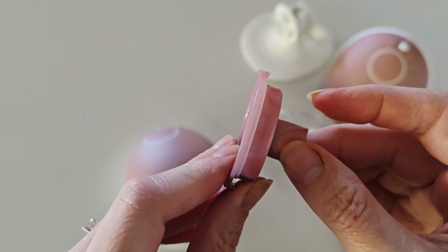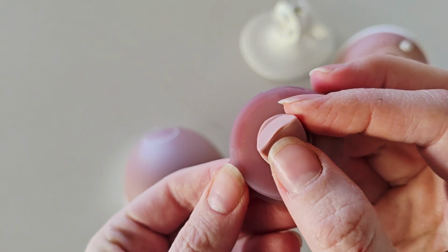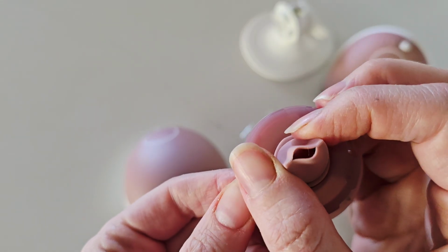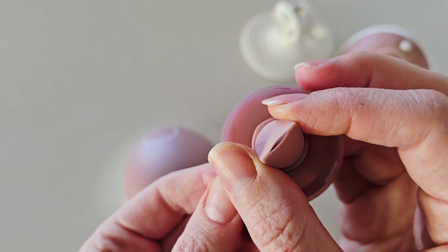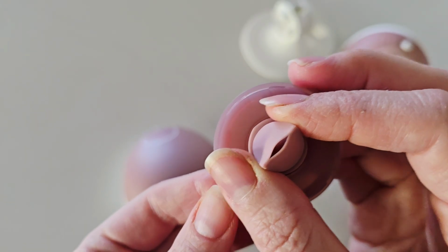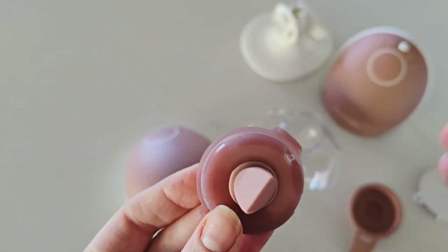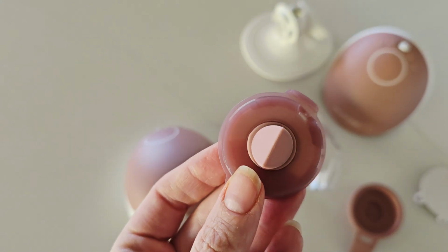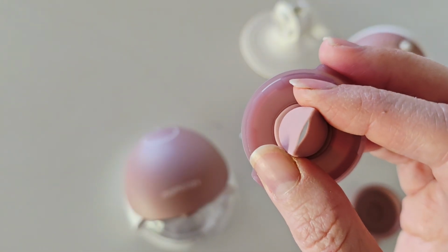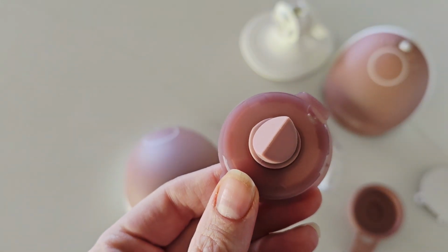So back to your duckbill valve, this is your two parts. You may notice, so this is a brand new one and you can see that this is nice and close together. You may notice that as this wears, it starts to open up a little and your seal then is no longer going to be as usable as if it is nice and tightly sealed. Again, it's all about creating your suction. So if you have a loss of suction, I would start with replacing your duckbill valve. When it's open, it obviously lets the air in and it's not doing its job.